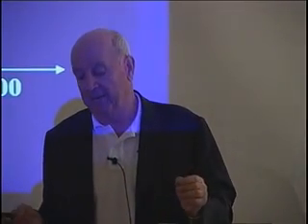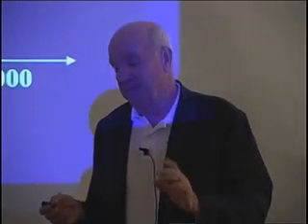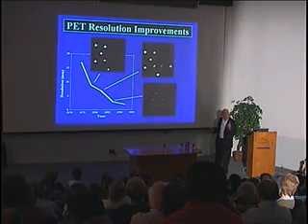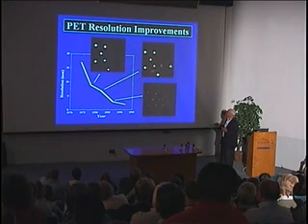This is hard for people to believe, but when you show what sensitivity improvement can be made, show what the dose calculations are and the benefit to understanding chemical metabolism in children so that we understand better behavioral abnormalities. It'll be hard to buy, but the dose, the numbers are there. Okay. Here's the improvement of resolution, a different story. One is to get enough sensitivity, the other is enough resolution, and you can see this is our pattern in the center, 2.3 millimeter resolution, generally out a few centimeters, 2.6 millimeter resolution that was existent in 1986. So this is what most systems operate at now.